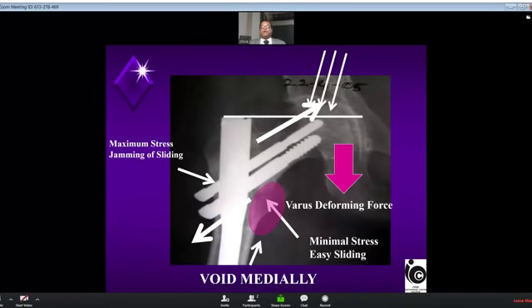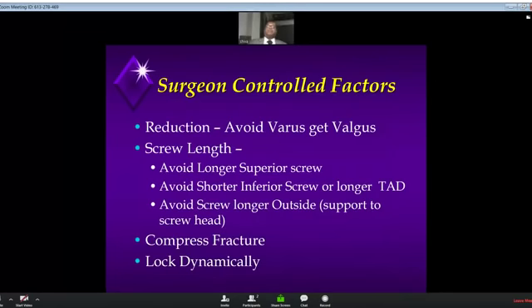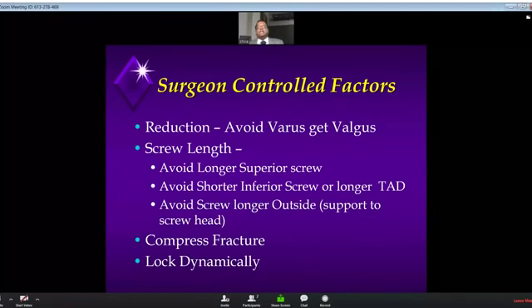This is more so common if there is a void medially. So that is one of the reasons why if there is a void medially, we should try to avoid this system, as said by the earlier speakers, but earlier articles. But anyway, I will try to give some solutions if there is a void also medially. Hence, how to minimize? As I said earlier, in my own hands in the last 8 or 9 years, there is only one Z effect.